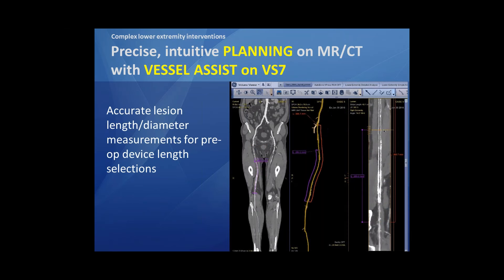Based on this stretched view, we can in a very accurate way measure lesion lengths, diameters, and so on, in order to prepare our procedure and to check if we have the right stent length and device length available on the shelf.